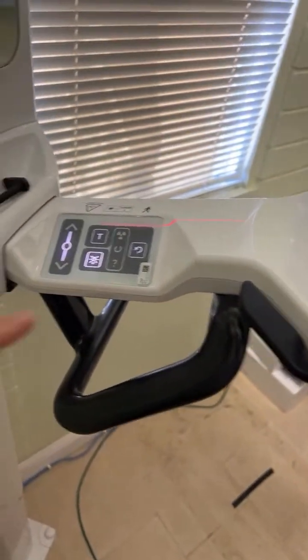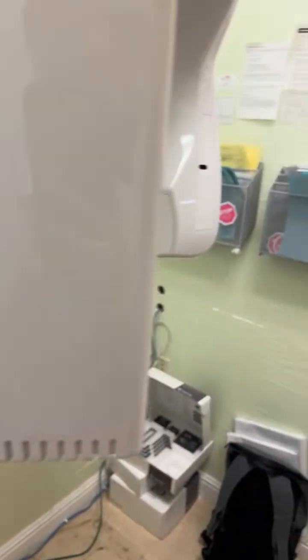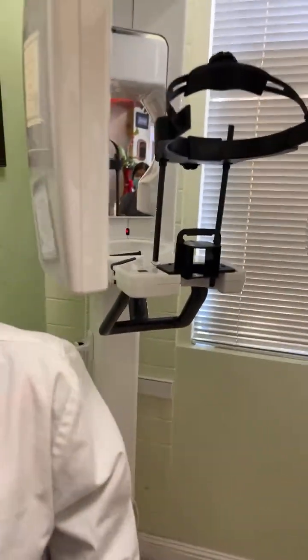So you need an apron. Press this one right here, okay? Set the chin. Put the chin up. I'll do it for her.